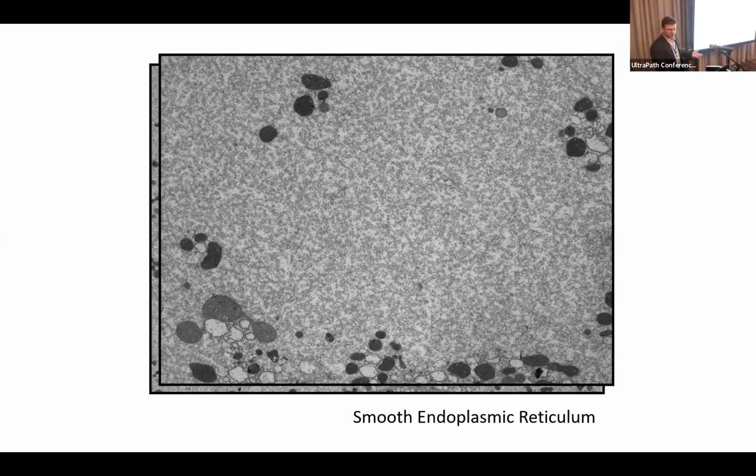Again, judging how much is too much comes down to experience, and so this argues why an electron microscopist should spend time looking at normal tissues. You won't know what's abnormal until you know what's normal also.